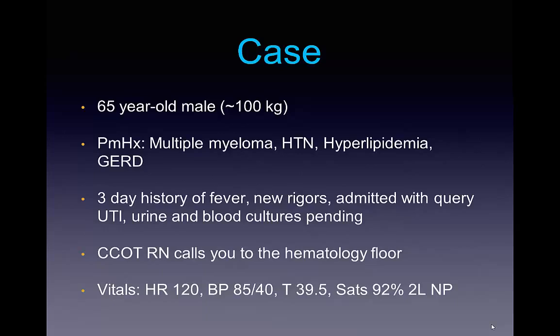If that attempt is successful, fantastic. Endotracheal tube is passed. At this point, you're not going to forget about your post-endotracheal tube management, which includes hemodynamic support, oxygenation support, and sedation. And after this, you're going to document your technique in addition to obtaining a chest x-ray and transferring the patient to a ventilated bed. So this was an overall approach to a patient who's critically ill with thinking about all of the different aspects that you need to consider.